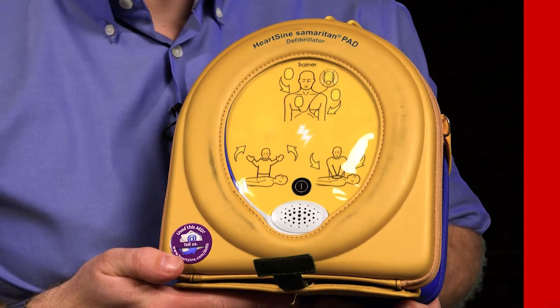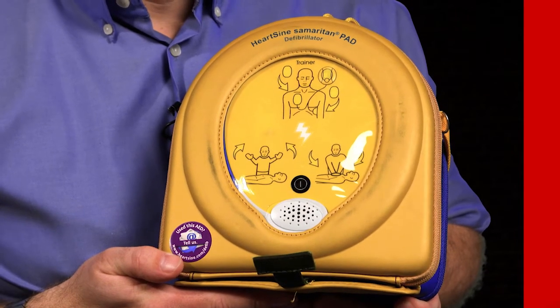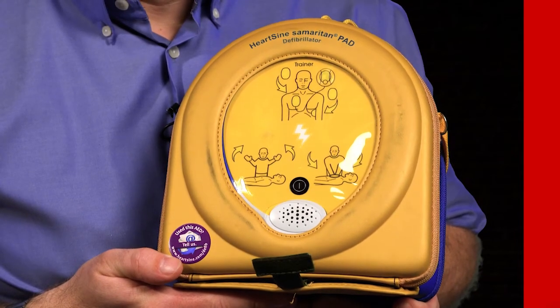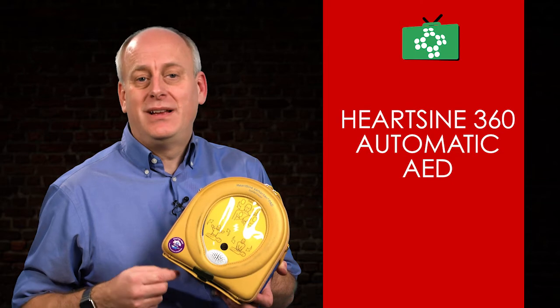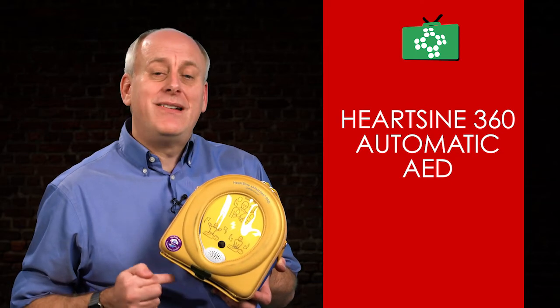The 360p is lighter and smaller than other defibrillators. It resists shock and vibration and carries an IP56 rating, which is the industry's highest rating against dust and water ingress. It also carries an 8-year warranty.